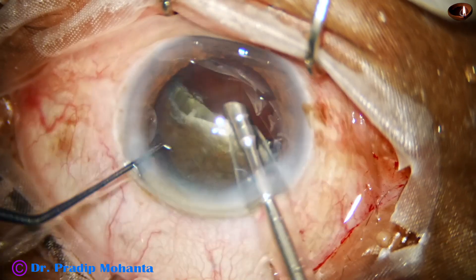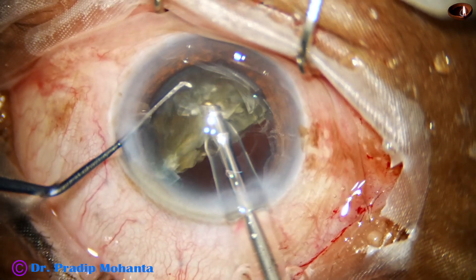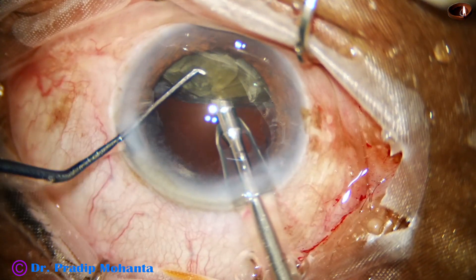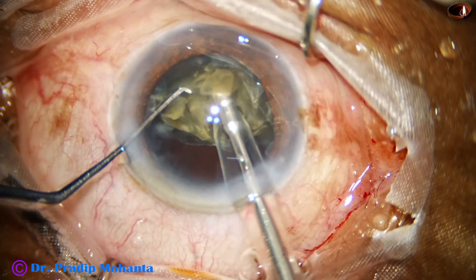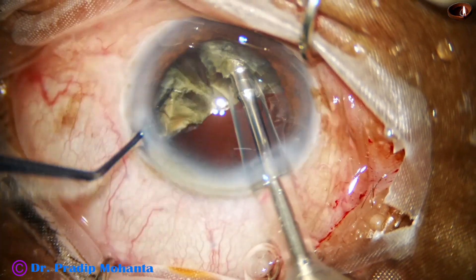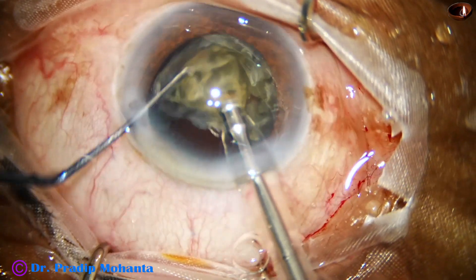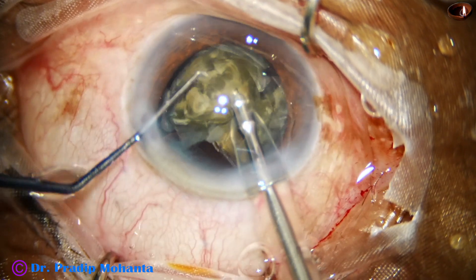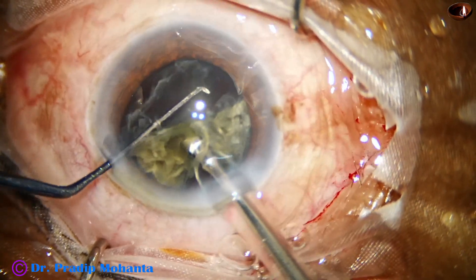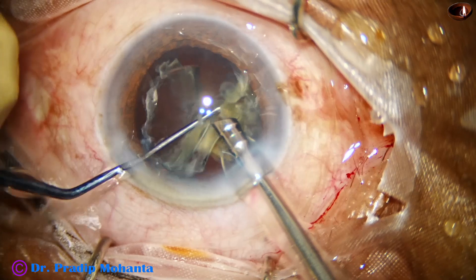I have managed one hemi-nucleus. Now I come to the other hemi-nucleus, hold it, and jaw. I find that the inner edge is not free — I have not got 2 free bases. So I tilt and use energy to make the inner edge thin, and then I could get 2 free bases. One free base is being emulsified. At this time, I am trying to detach the epinuclear shell, use it to protect the posterior capsule, and emulsify only the nucleus. Yes, I have been able to do that.